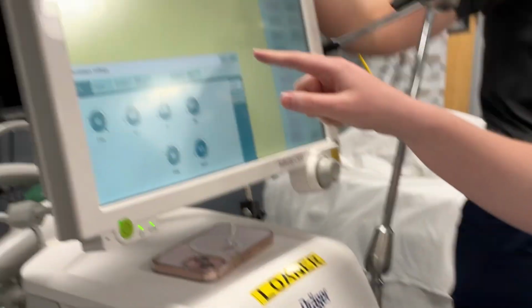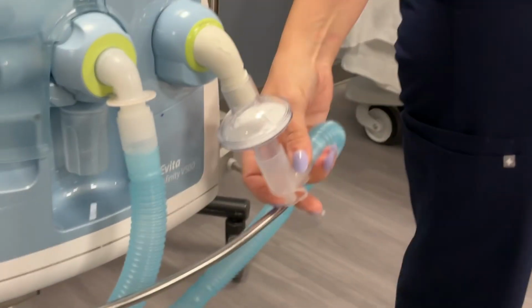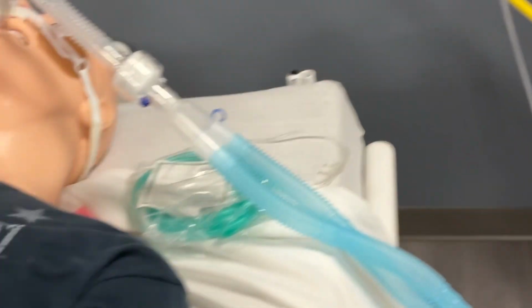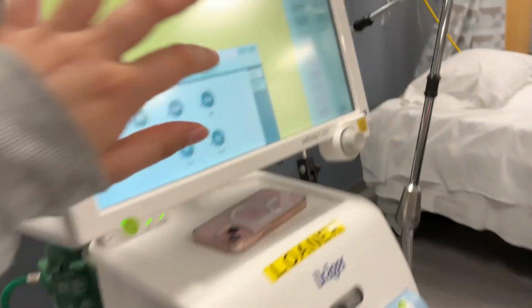Set up your ventilator circuit. So everybody remember how to set up the vent circuit? Bacteria filter on inspiratory, right? Inspiratory limb, inspiratory, HME. Yep. You're in line, then you're going to do your check. So now you're going to place Brett on these things. So go ahead and start ventilation for me.